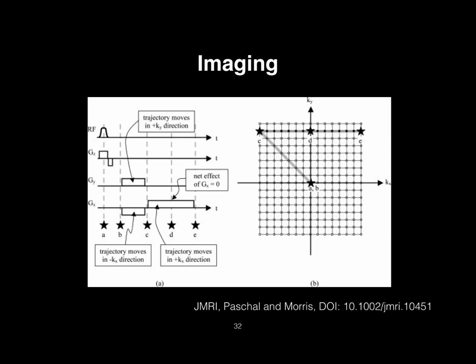And almost all imaging involves trying to fill out k-space. Here it's in a Cartesian pattern, and this is still the majority of what we do, but there are some more interesting ways that you can accomplish acquiring the data that fills you out, depending on what you do with your gradients. Okay. A couple things to keep in mind now. Remember, you're going to acquire this data and essentially do a transform on this to get your image.